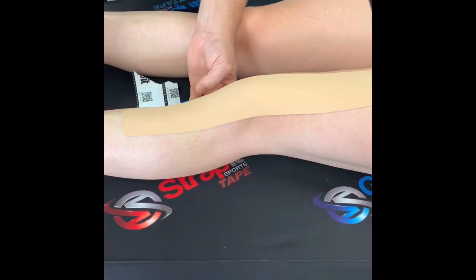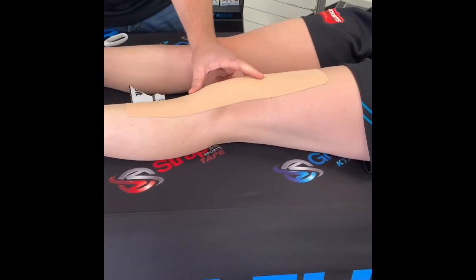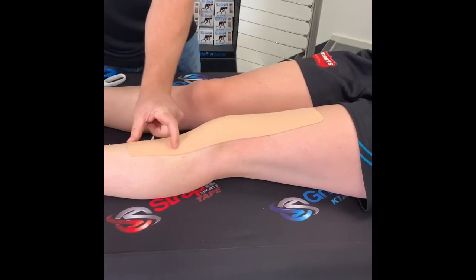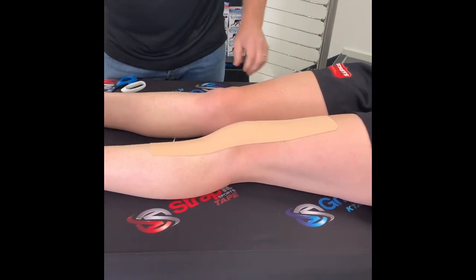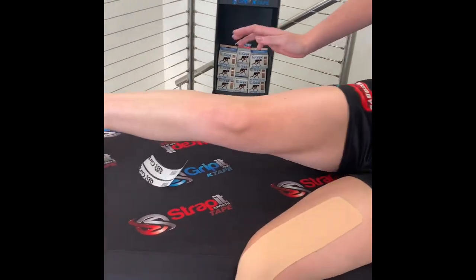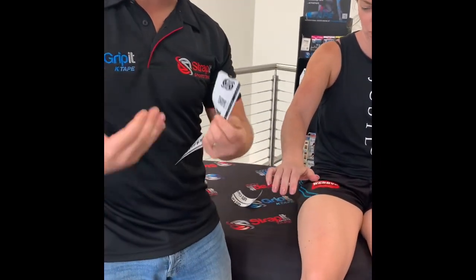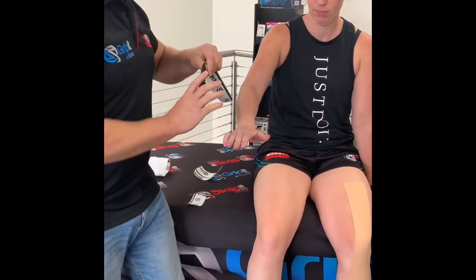So if Amy here just bends up the leg for me, okay, so what happens is that the tape from here to here is getting energy storage in and out, so potential energy, kinetic energy, and because we have large anchors, we're protected and the skin at the ends are protected. Okay, Amy's gonna swing around the table now with her legs over the edge, and I'm going to come around and I wanna show just one more application, again to talk about the anchors and about the importance of no stretch and also making sure those anchors are generous.